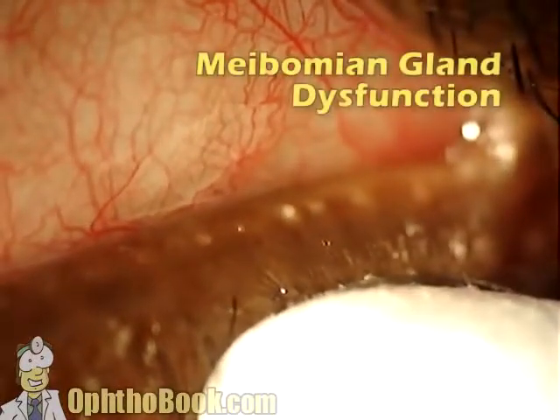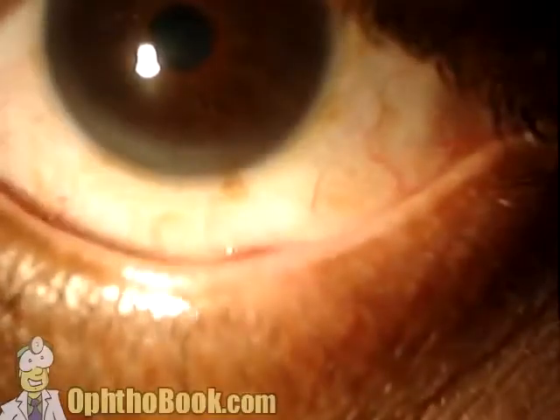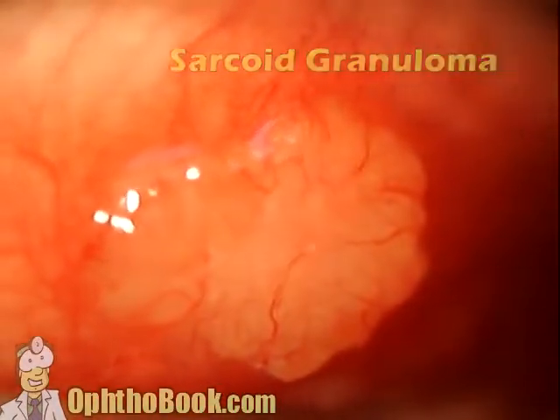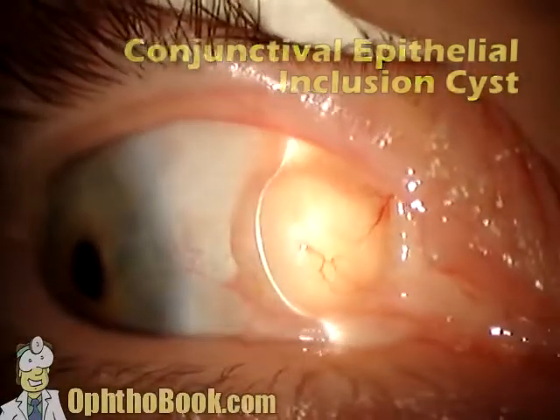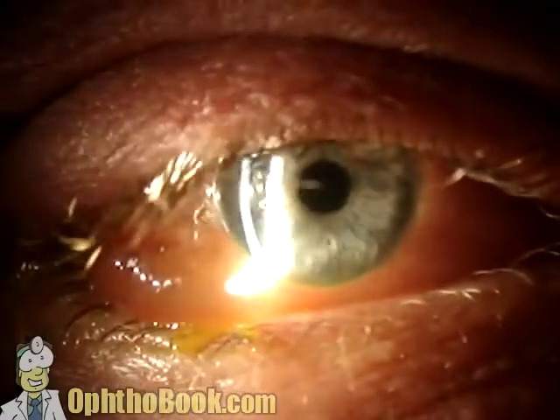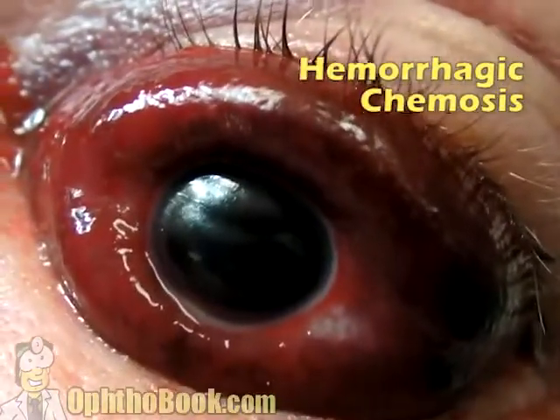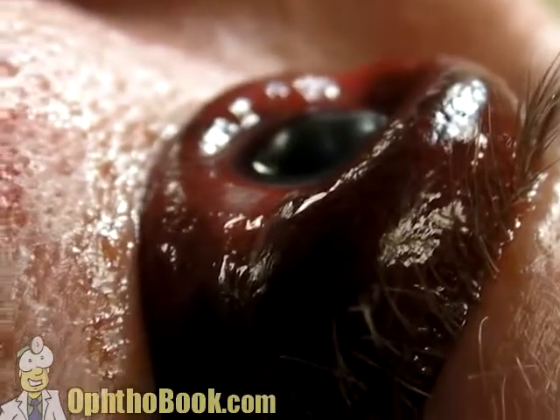Collarettes, scurf, and junk on the base of the eyelashes — you see this with anterior blepharitis. This is a case of posterior blepharitis where the meibomian glands become clogged up; when we push with a Q-tip, you can see that whitish oily material oozing out, causing a lot of issues. Why do I flip the eyelid? Because sometimes you have things like pyogenic granulomas associated with chalazions. Here's another lesion on the upper lid — a granuloma we biopsied that turned out to be sarcoidosis. The conjunctiva here has a very large cystic structure — it's benign because it's clear. This is chemosis, usually associated with allergy.